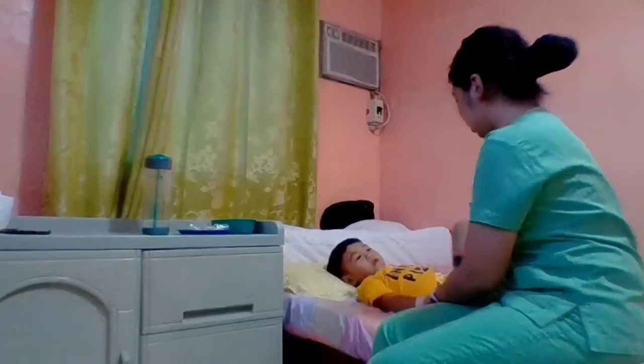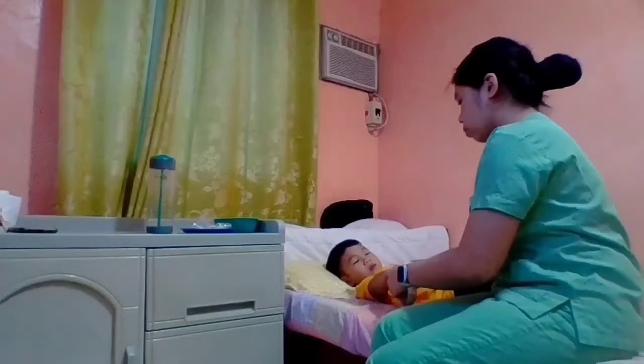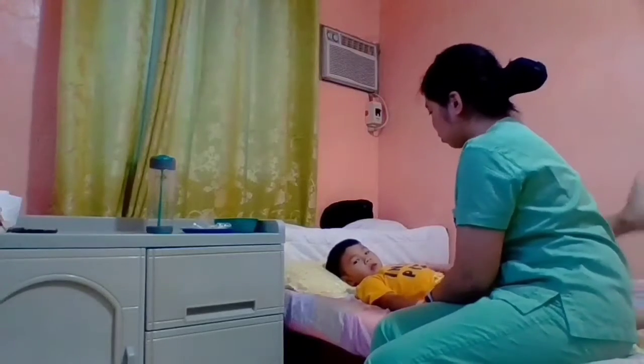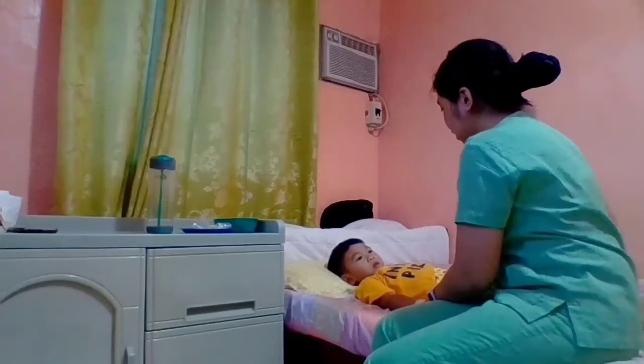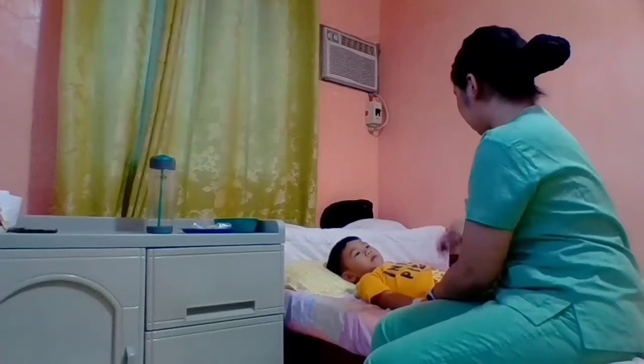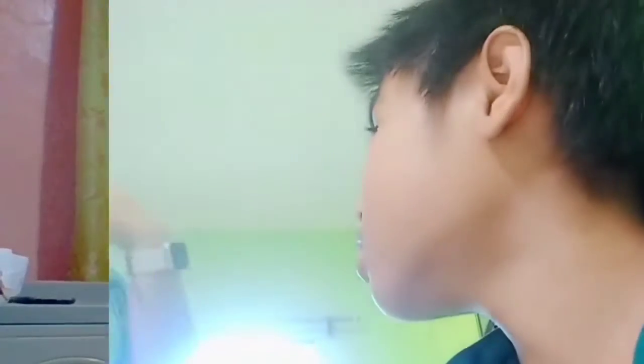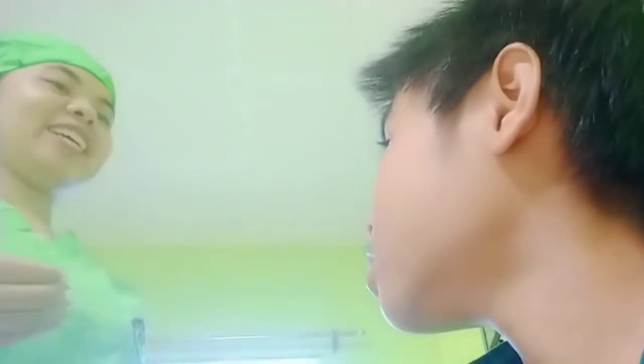Identify the patient using the 3 methods and compare information with the MAR. Check the name and identification number on the patient's identification band. Ask the patient to state his or her name. If the patient cannot identify him or herself, verify the patient's identification with the staff member who knows the patient for the second source. Close the door to the room or pull the bedside curtain.